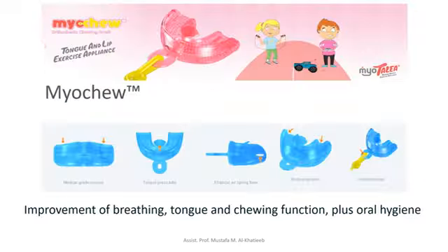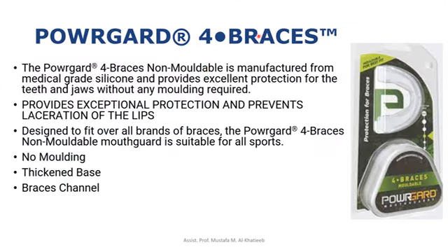Soft and hard. The MyoChew is another type. The MyoChew improves breathing, tongue, and chewing function plus oral hygiene.